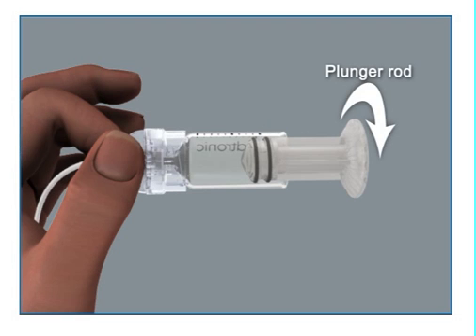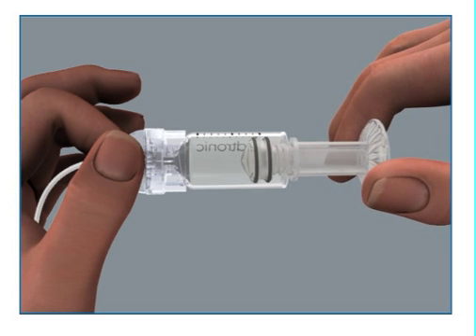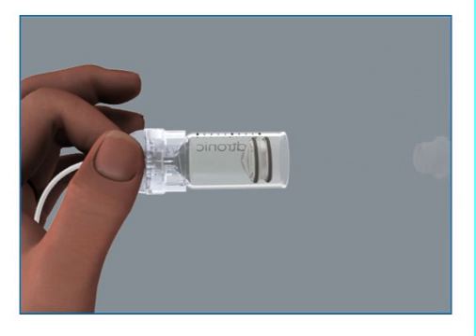Unscrew the plunger rod counter-clockwise until it completely separates from the reservoir. Be careful not to pull down on the plunger as you unscrew the plunger rod, and avoid squeezing the o-rings as you do so. The reservoir is now filled and ready to be inserted in the reservoir compartment of your pump.